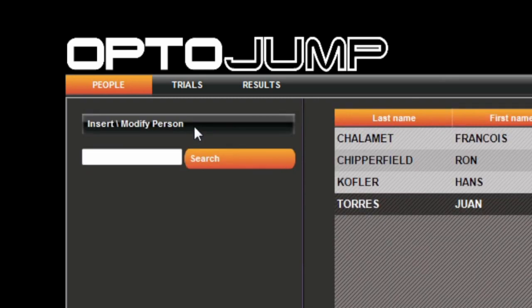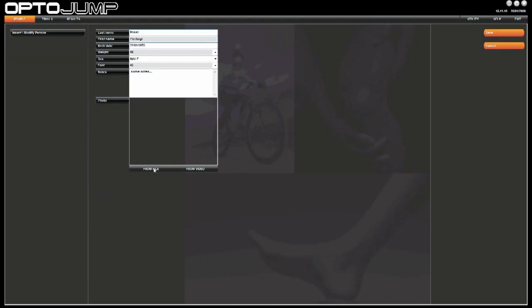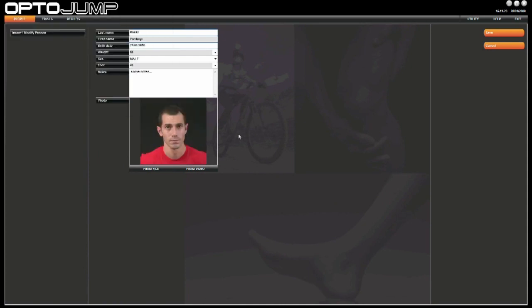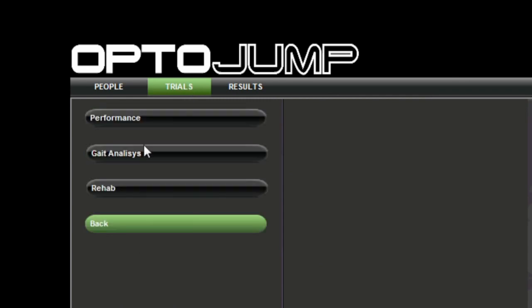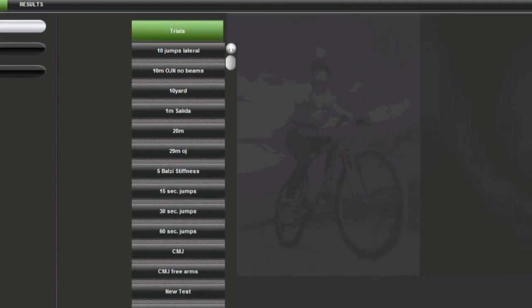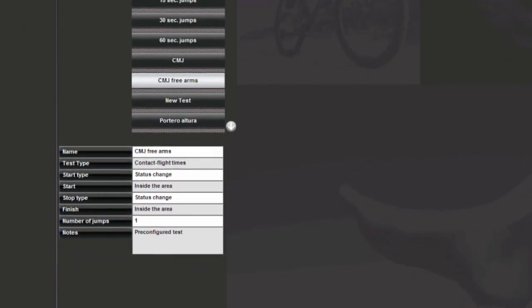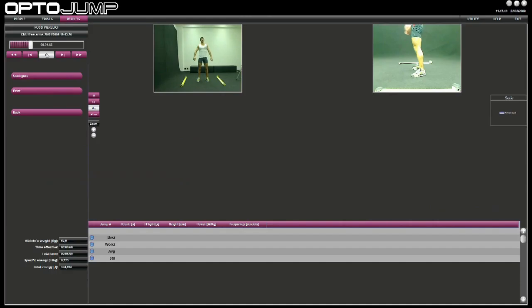The Master Data section contains the athletes' or patients' profiles. Each profile can contain any type of information, from the athlete's name to his or her photo. The Tests section allows users to create and configure new jump, reaction, or running tests. It is then possible to carry out the tests by selecting standard tests or tests created by the user.